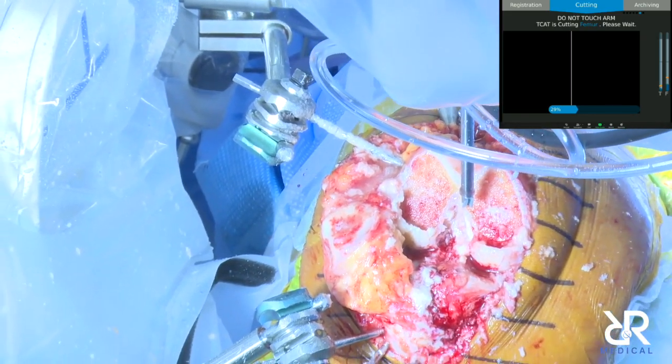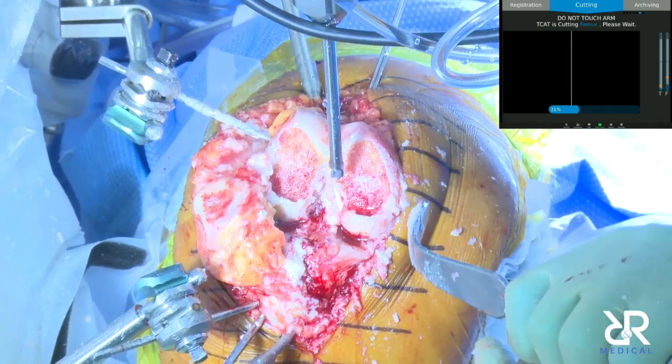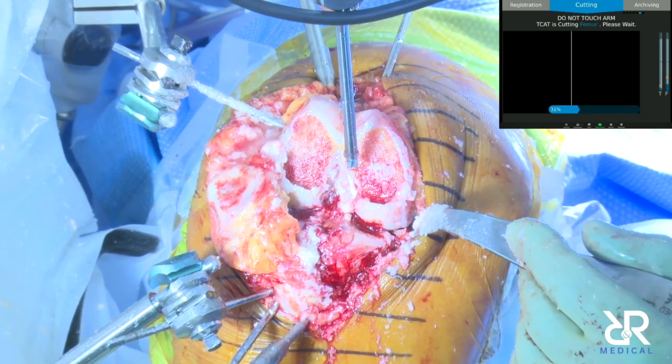So the new robot is also more efficient. I think it's even more accurate. And the planning is really what makes the big difference, because you can now adjust your distal femoral cut, which you cannot with this software.